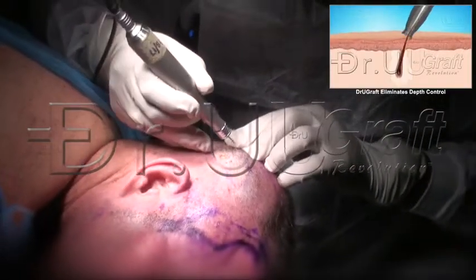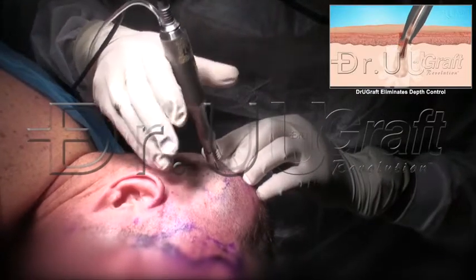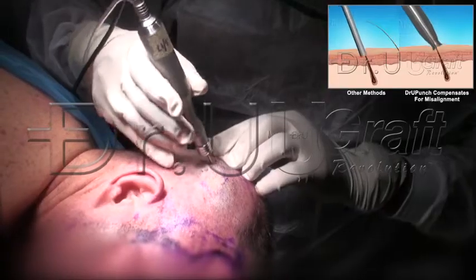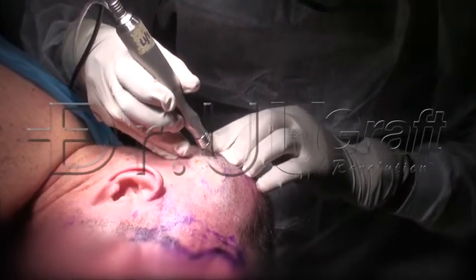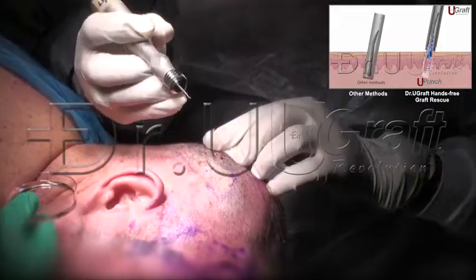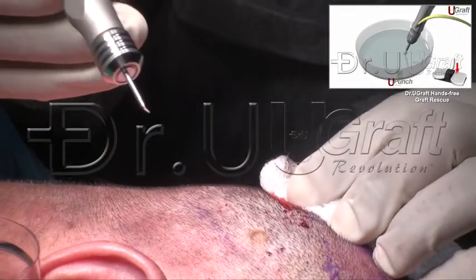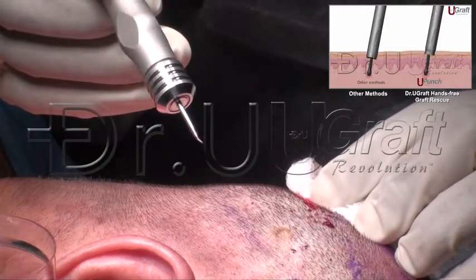No depth control. Now attempt to align — we just need to get to the root of a hair. And as you can see here, that's an entire graft from just this very casual, cavalier method. No skills whatsoever required.